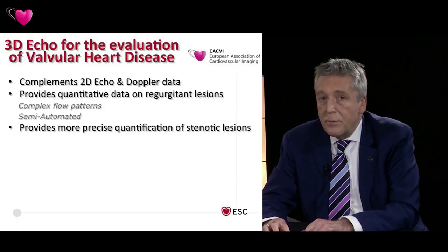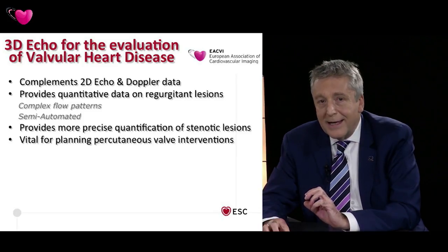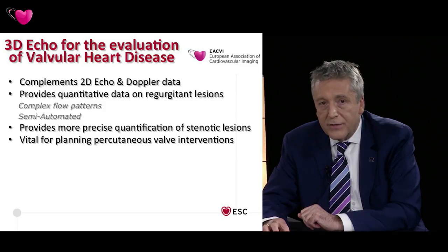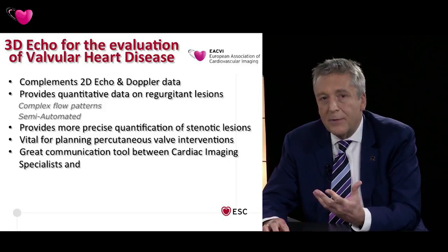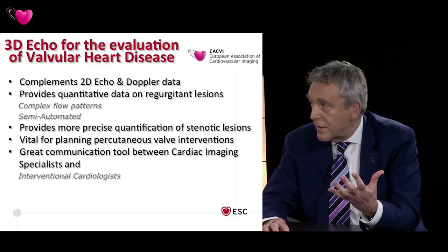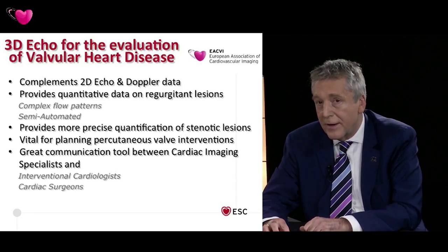It provides a more precise quantification of stenotic lesions because we can directly planimeter the true valve area, and as you're going to hear in a minute, is absolutely vital for planning percutaneous valve interventions, and is a great communication tool, not only in the cath lab between cardiac imaging specialists and interventional cardiologists, but also, as I showed you, in the operating theatre with our cardiac surgeons who actually have to operate on these valves.